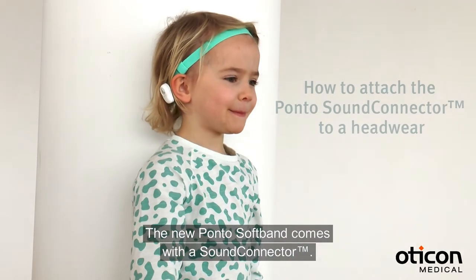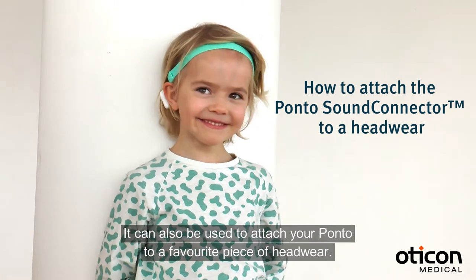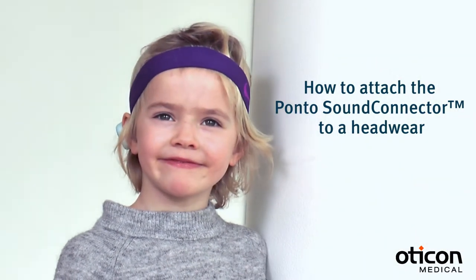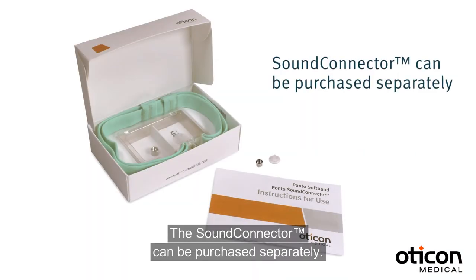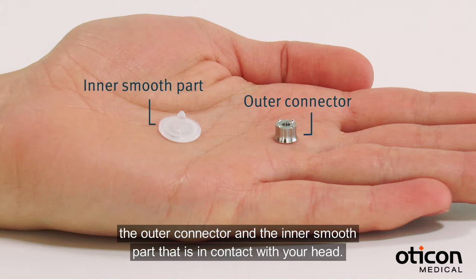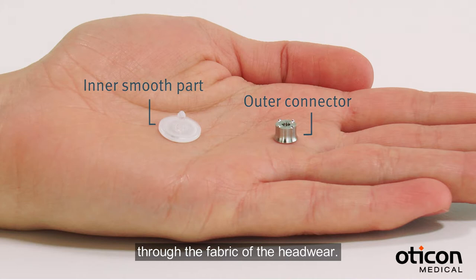The new Ponto SoftBand comes with a sound connector. It can be used to attach your Ponto to a favorite piece of headwear. The sound connector can be purchased separately. It consists of two parts: the outer connector and the inner smooth part that is in contact with your head. These two parts are attached by pressing them together through the fabric of the headwear.